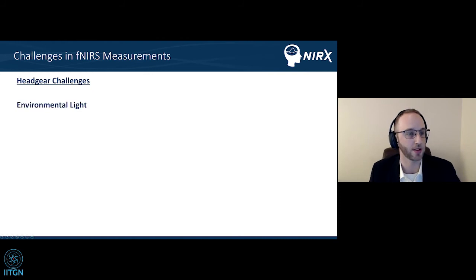Other headgear challenges. Environmental light can be a major factor. Of course, we're measuring light.